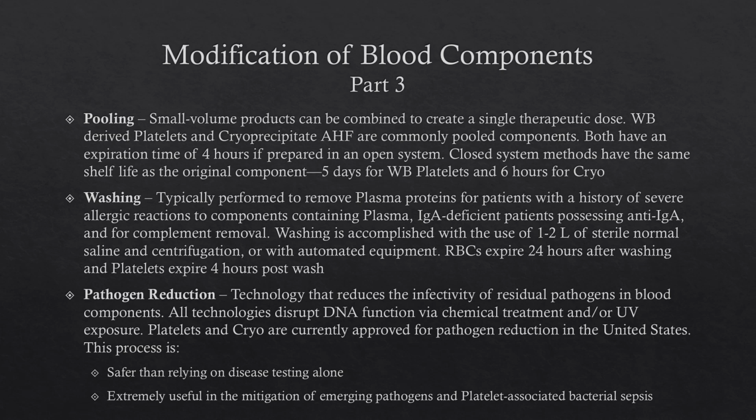Both of these, because they're going to be stored at room temperature after the pooling, have an expiration time of 4 hours, unless it was done sterilely. If you had a way to combine and pool these, say with a sterile docker, then you can stick to the original expiration date for both of those components.